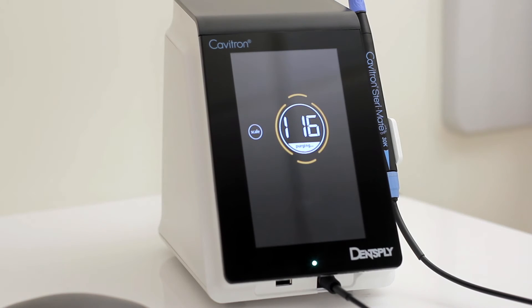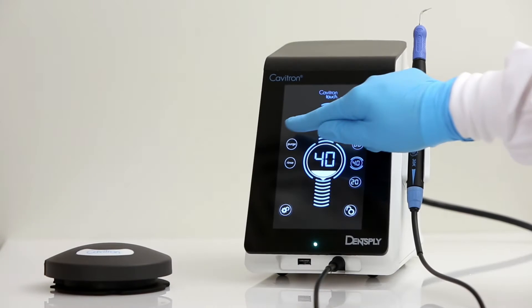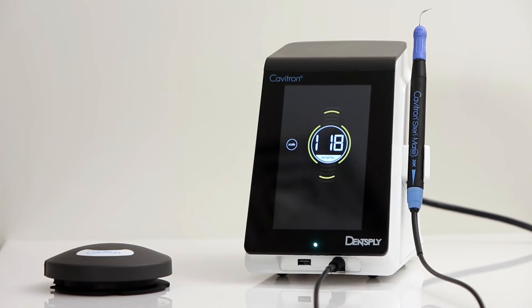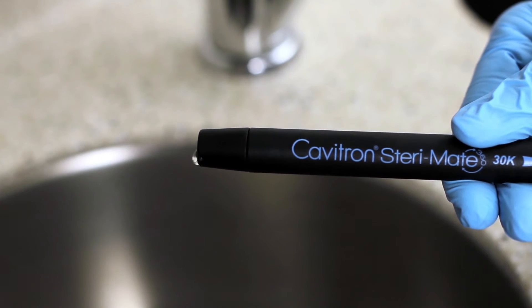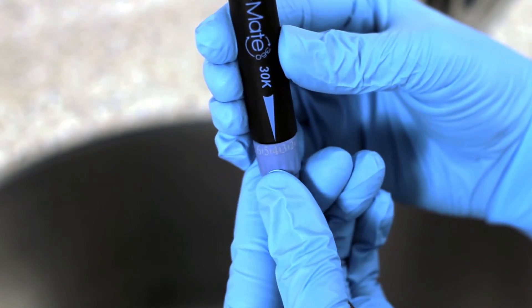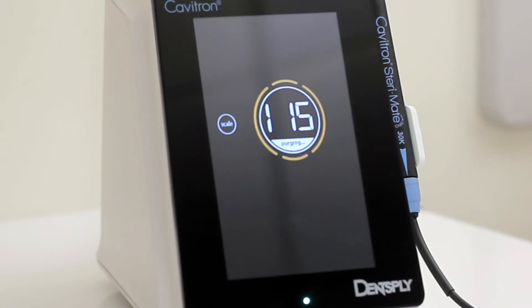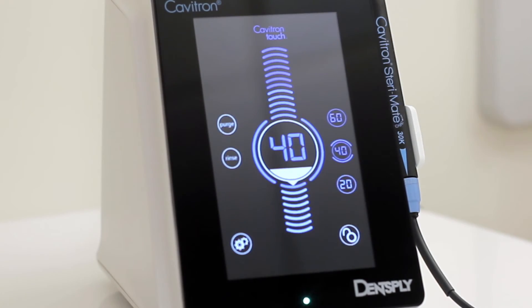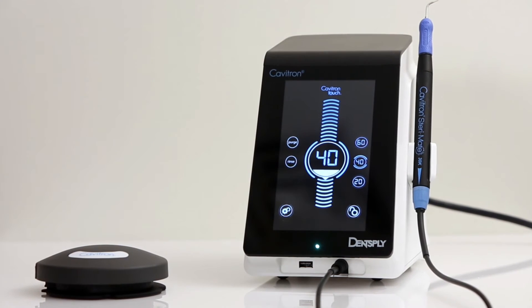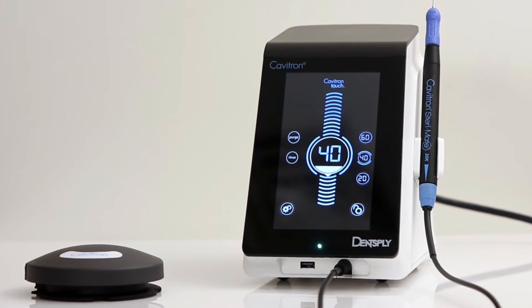Use of purge feature. This setting is used to flush the water lines at the beginning of the day or between patients. Purge will run automatically for 2 minutes, and adjustments can be made for maximum water flow, with a countdown in seconds shown on the screen. Push the scale button to return to the main screen or simply tap the foot pedal. After a 2-minute countdown, it will then return to the main screen.